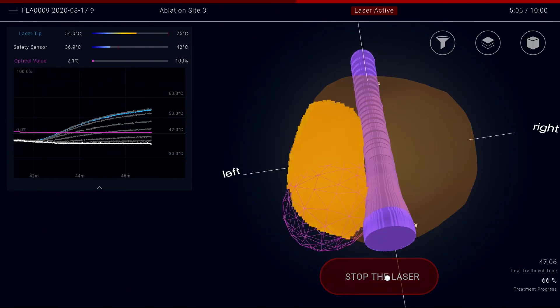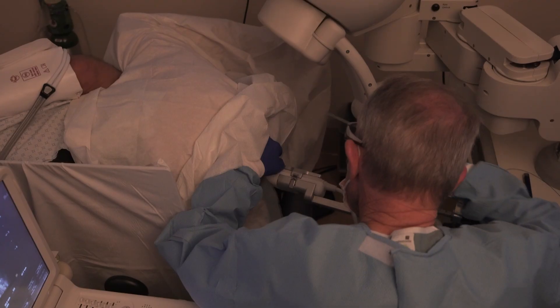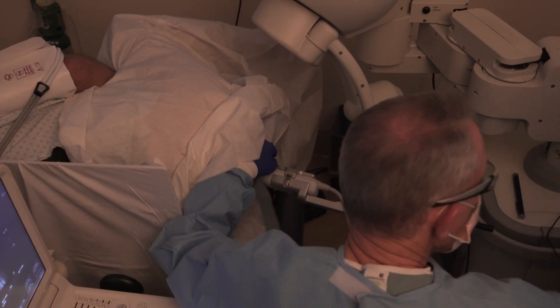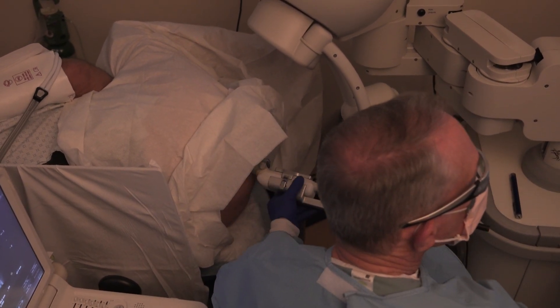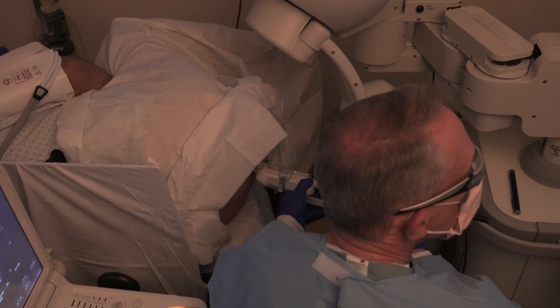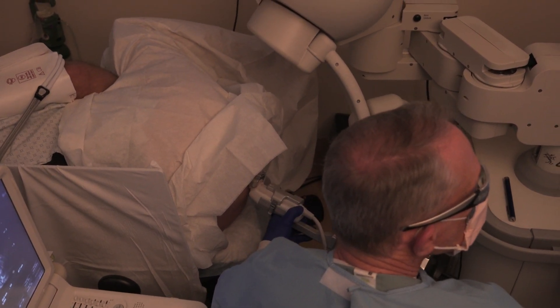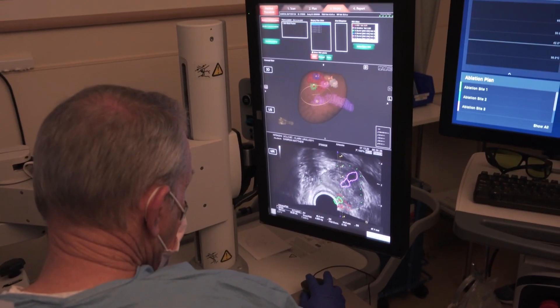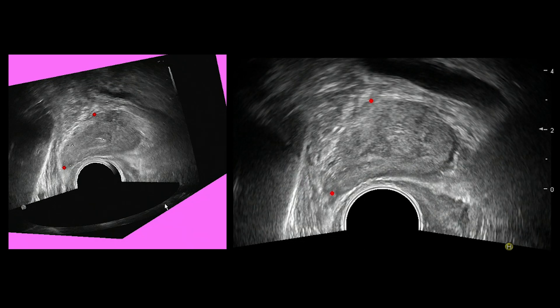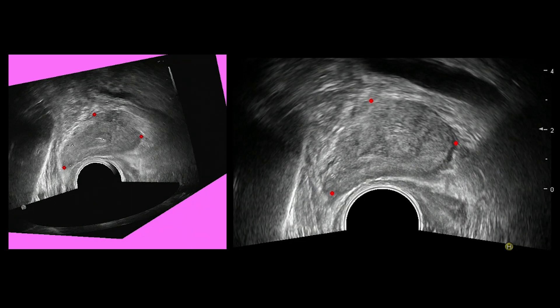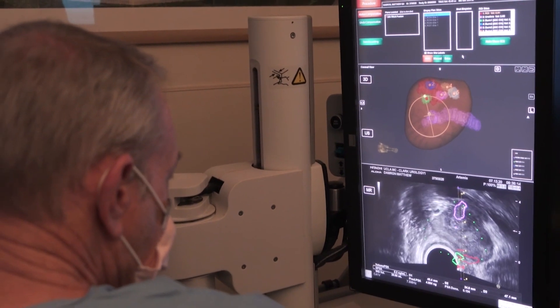After stopping the laser, saline is allowed to flow until temperatures are below 42 degrees, thus preventing rectal wall heating upon withdrawal of hot treatment elements. For subsequent ablations, the laser and thermal probe are moved into position by rotating or angling the ultrasound probe as needed. The operator reconfirms co-registration. If needed, a motion compensation is performed to realign the MRI and ultrasound images. Repeat the process previously described to perform subsequent ablations.